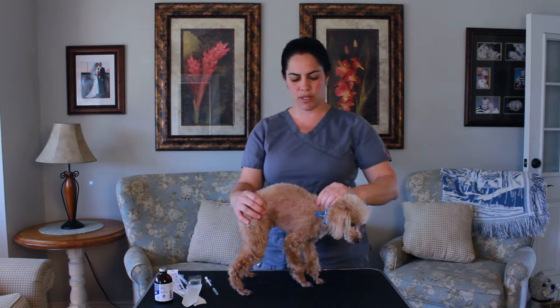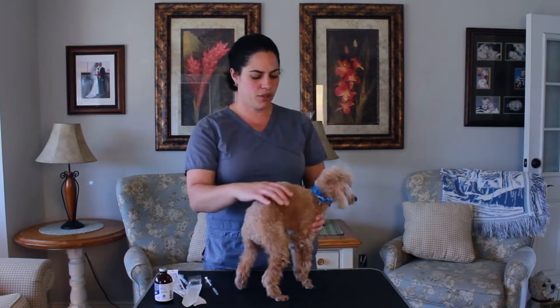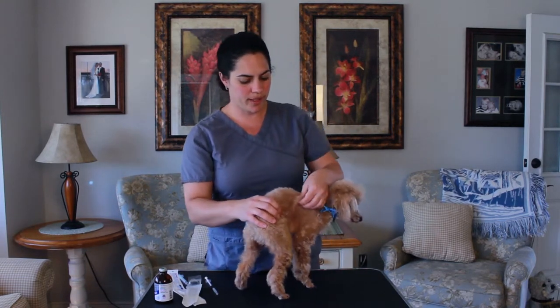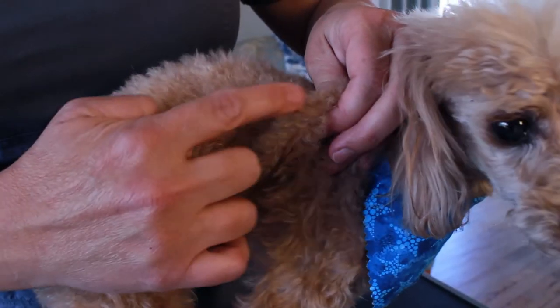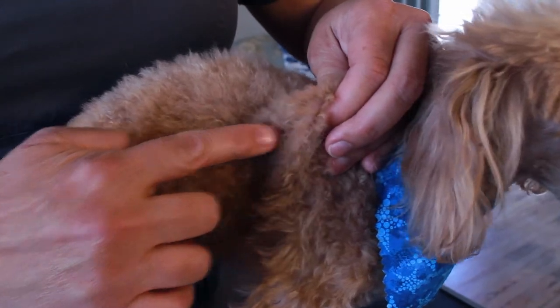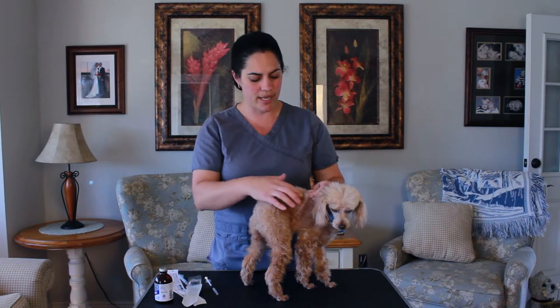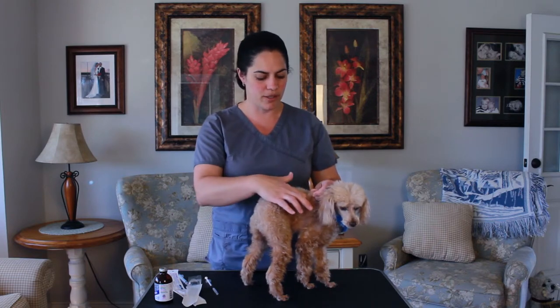A lot of vets will actually teach you to go up between the shoulder blades as well. So what you're going to do is pull up the skin wherever you want, pull up the skin and make a tent like you're going camping. Use your finger to feel the space there and make sure you're not going to hit anything — not your finger, not any muscle, nothing other than just empty space.